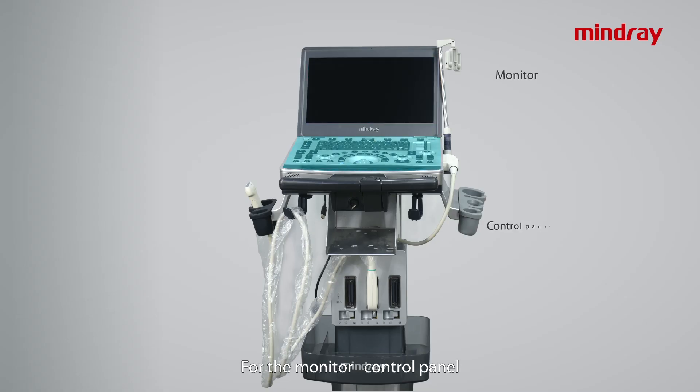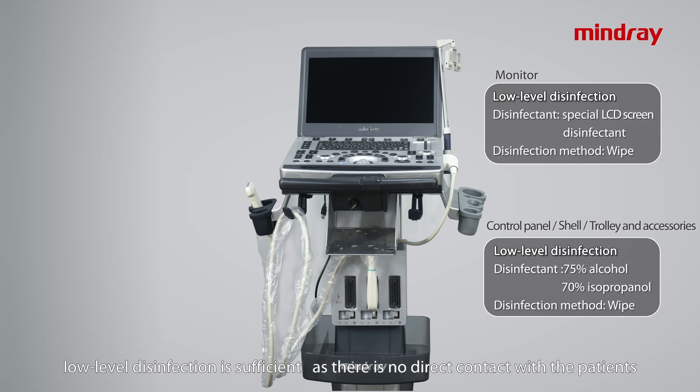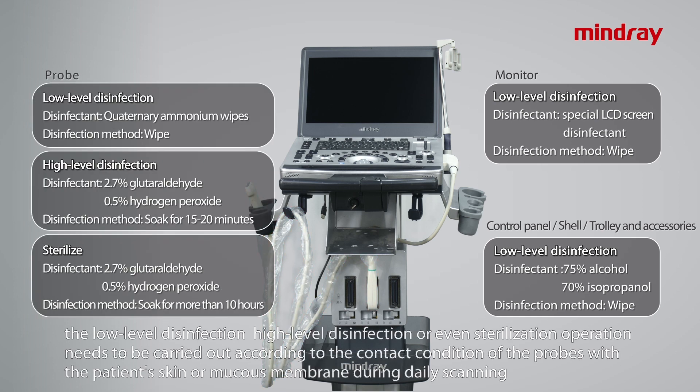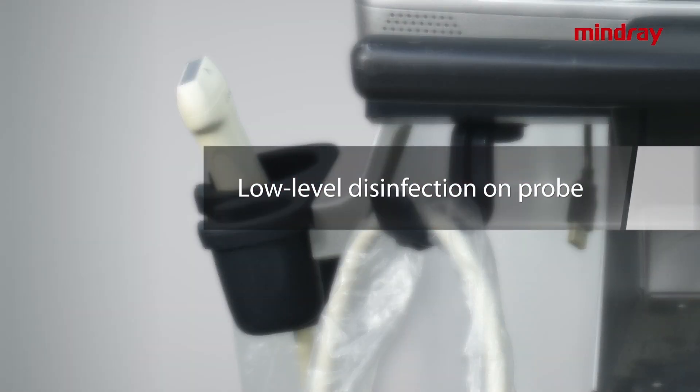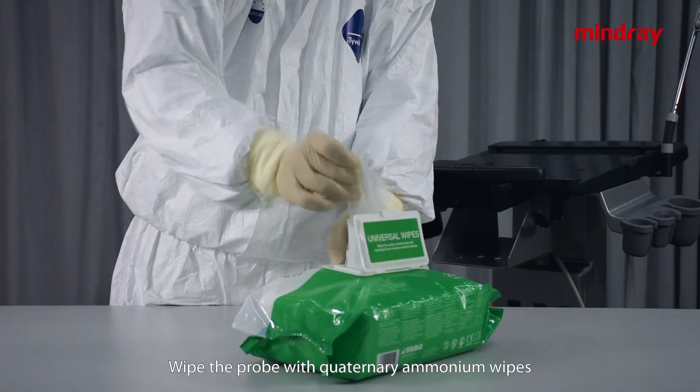For the monitor, control panel, shell of the main unit, trolley and accessories, low-level disinfection is sufficient as there is no direct patient contact. For the probes, low-level disinfection, high-level disinfection, or even sterilization needs to be carried out according to the contact condition of the probes with the patient's skin or mucous membrane. During daily scanning, low-level disinfection: wipe the probe with quaternary ammonium salt wipes.